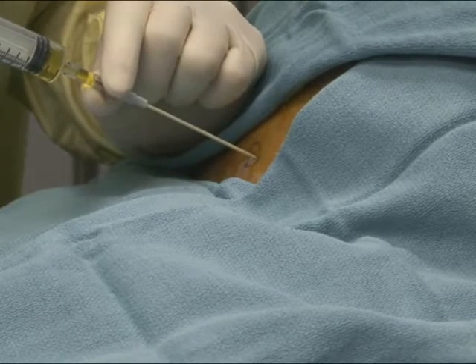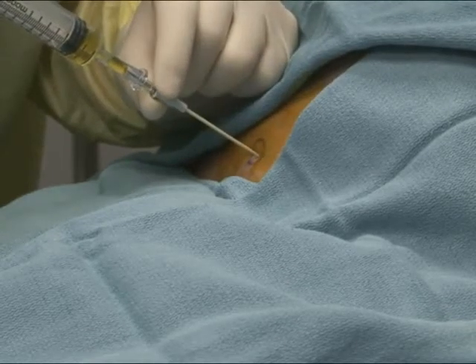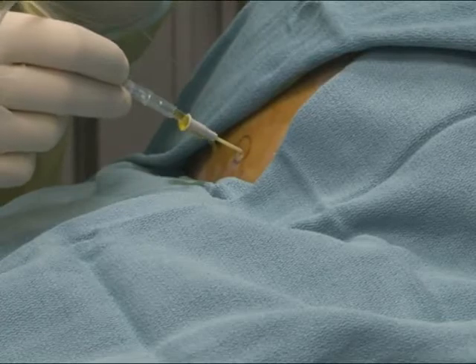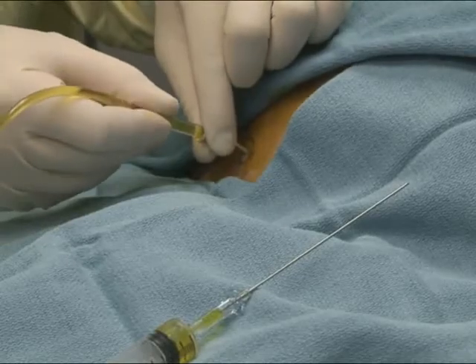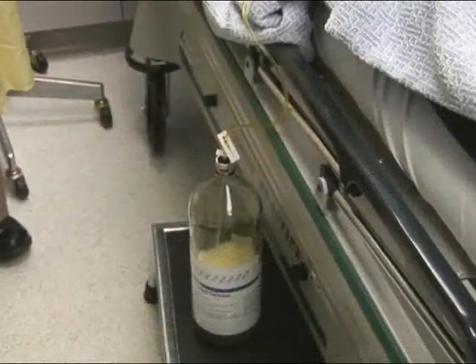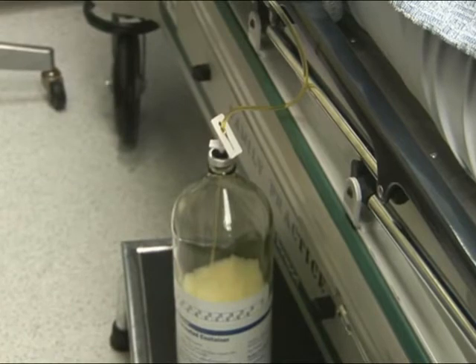When the cavity is entered, advance the needle and catheter another 2 millimeters, then slide the catheter forward off the needle and remove the needle from the assembly. Free-flowing fluid should come out of the catheter. Attach the connector tubing to the catheter, then quickly connect it to the collection bottle. A stopcock system or tubing clamp is used to regulate the flow when transferring bottles to avoid spillage.